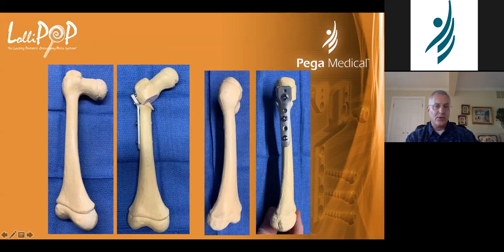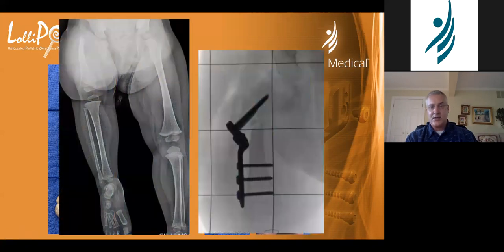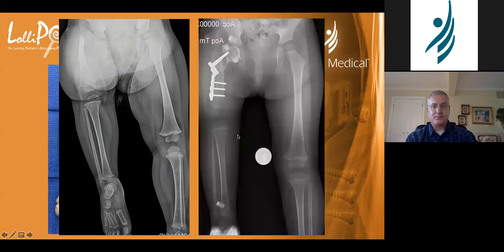So this is the little guy who we started, actually a little girl, and this is the end result. This is her little epiphysis. So she had a neck shaft angle starting about 60, and she ended up with 130. This is when I do ankle work as well. So I removed wires and then an arthrogram, and you can see the blade plate riding a little high, but very strong.